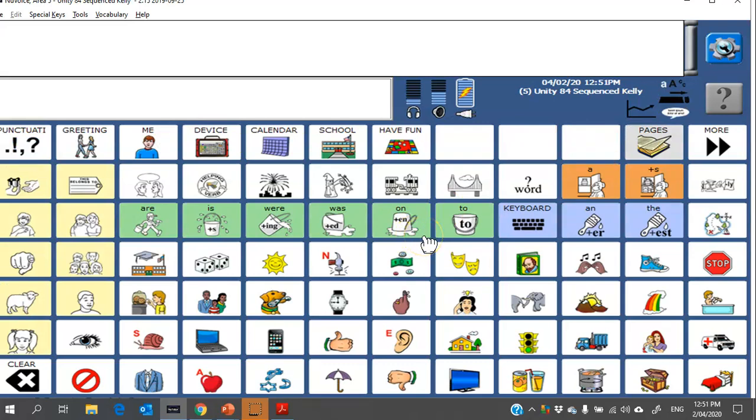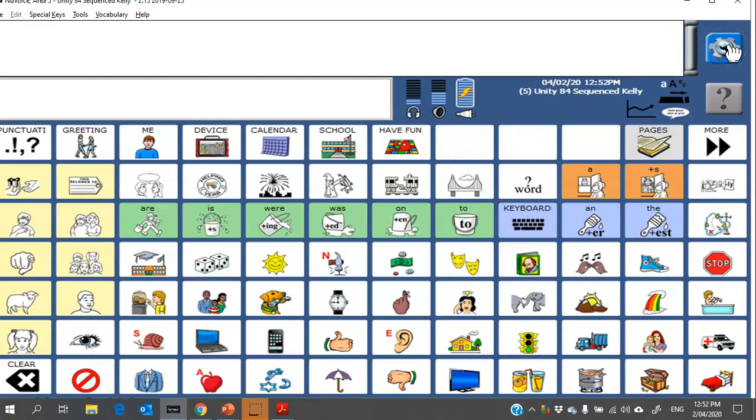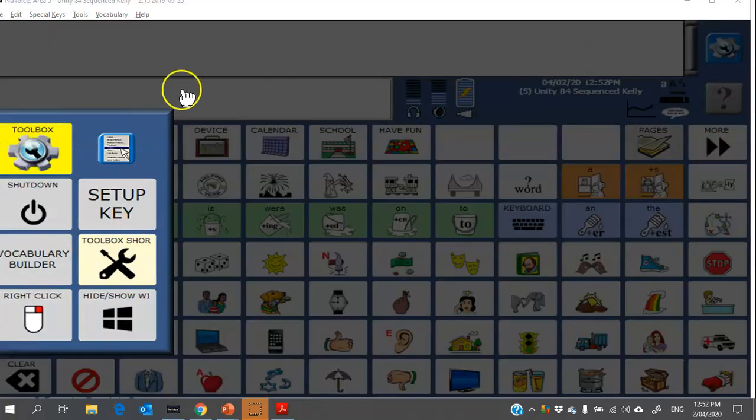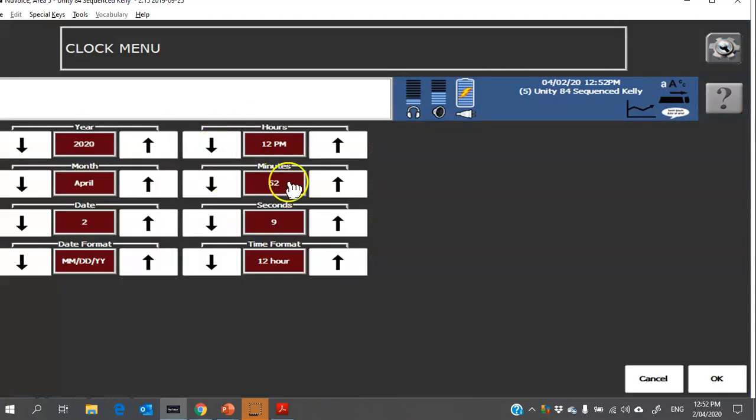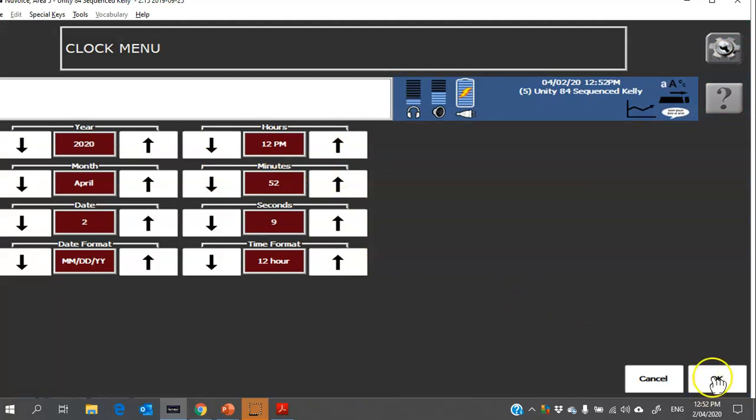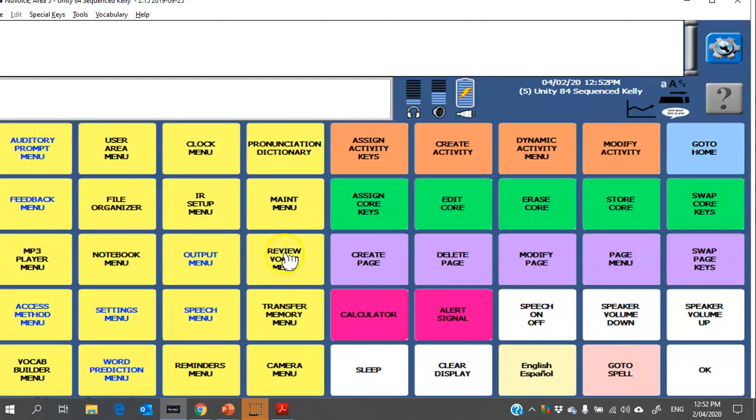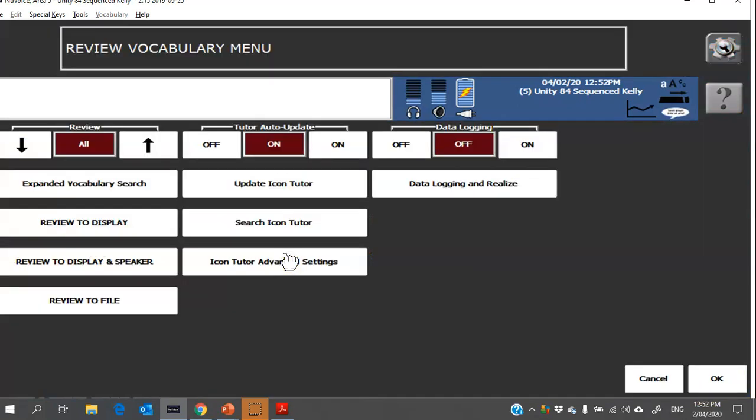Data logging. Particularly if you're doing a trial, it's important to collect evidence in terms of how much the individual used the device. So to turn on data logging, you first want to check that the clock is correct because the data logging report will have the specific dates and times. So to do that you would go into your toolbox, yellow toolbox, clock menu, and from here you can adjust the date and the time. Once you've done that you're going to head into review vocabulary menu, and here is the data logging so you want to make sure that's turned on.